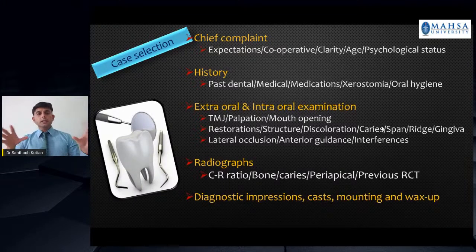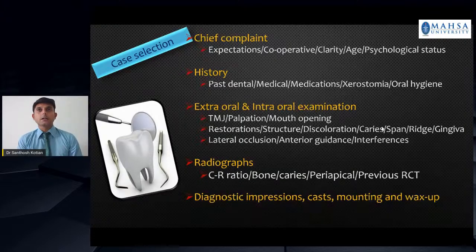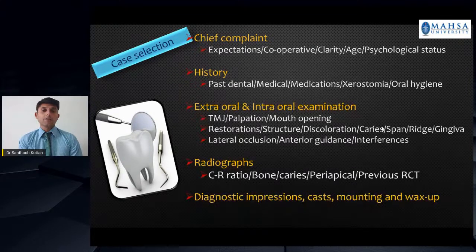And again, coming to one of the most important things: diagnostic impressions, cast, mounting, and wax up. Now, one thing I would like to add here is that when we say impressions, we always associate it with prosthodontics, right? I want to highlight that please do not consider impressions as a prosthodontic procedure. That is, it is not that I have to make an impression only when the patient needs replacement of teeth. No, that's not the thing. Always make a diagnostic impression and diagnostic cast. For most of your cases, it's always helpful.